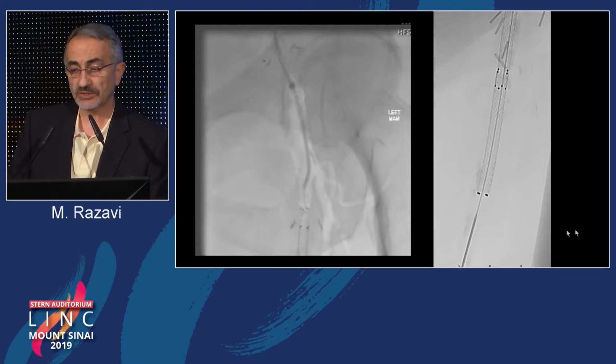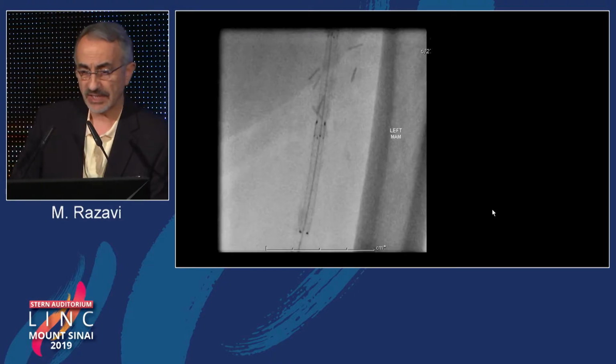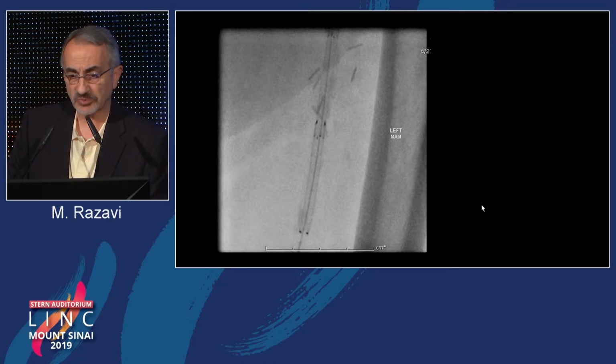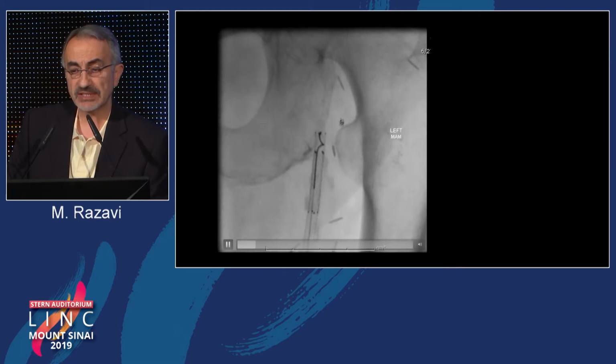Or you can go below it, and we typically go into the diseased portion that is patent. The reason is that when we come from the contralateral side, sometimes we have to put a balloon or stent there. And here it is coming up, and you can see we did have a stump there, so we see a little bit of an aggressive push right here to break through the cap backwards.